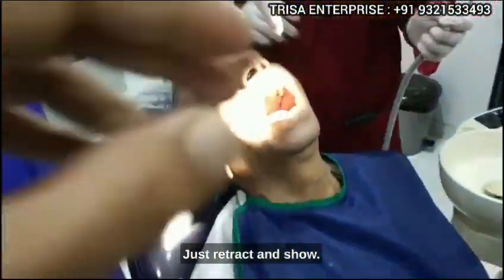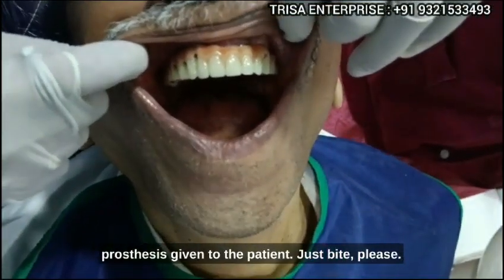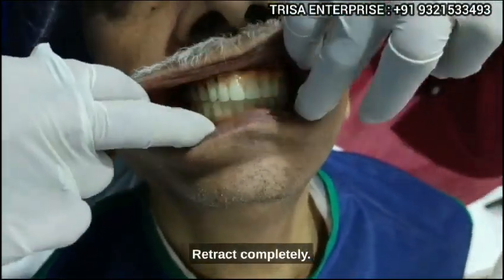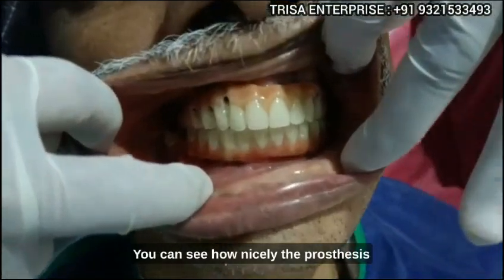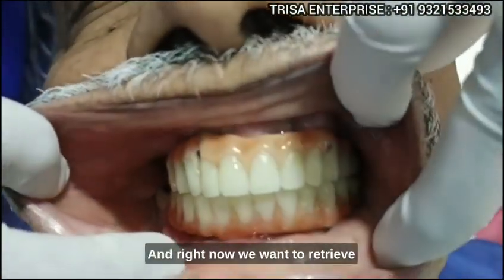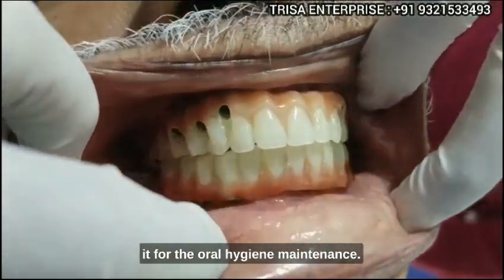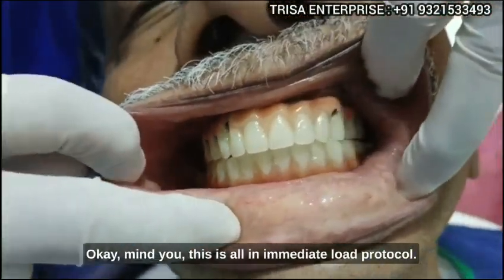Here I am, just retracting to show you — you can see the wonderful prosthesis given to the patient. Just bite please, just bite. Retract completely — you can see how nicely the prosthesis has been fitted in the mouth.